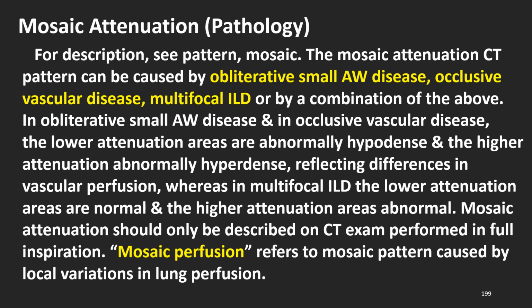Mosaic attenuation should only be described on CT exam performed in full inspiration. Mosaic perfusion refers to mosaic pattern caused by local variations in lung perfusion.